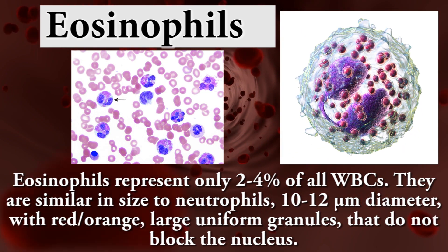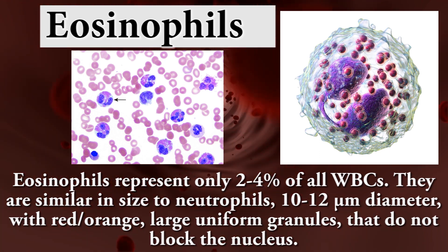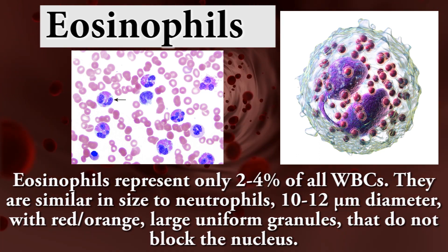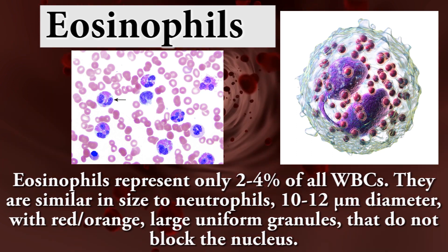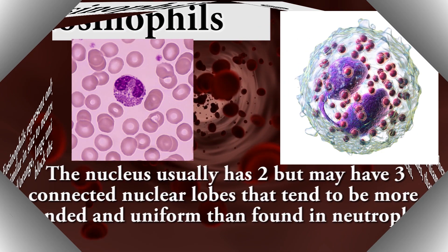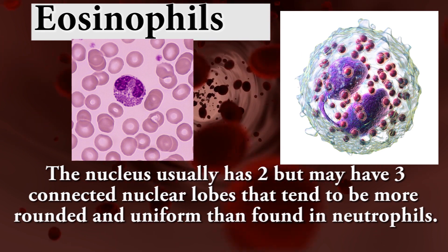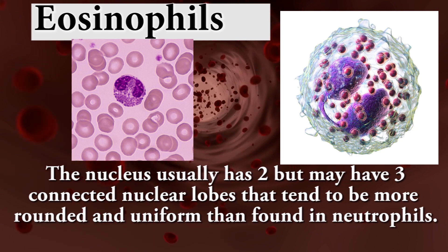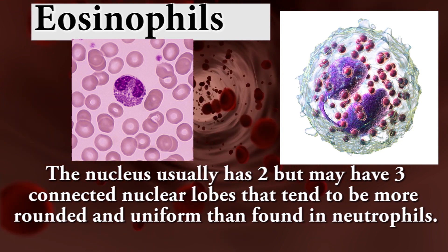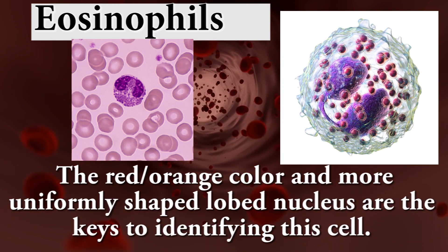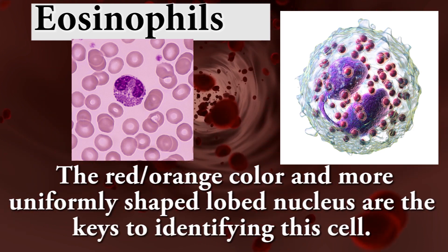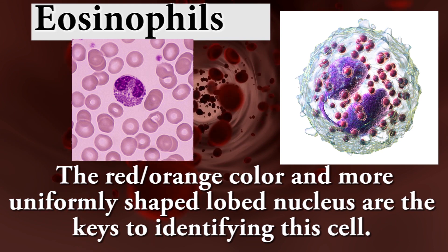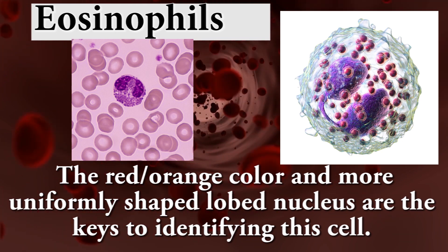Eosinophils represent only 2 to 4% of all WBCs. They are similar in size to neutrophils — 10 to 12 micrometers in diameter — with red or orange large uniform granules that do not block the nucleus. The nucleus usually has 2 but may have 3 connected nuclear lobes that tend to be more rounded and uniform than in neutrophils. The red or orange color and more uniformly shaped lobed nucleus are the key to identifying this cell.